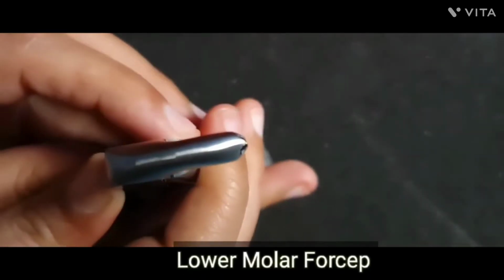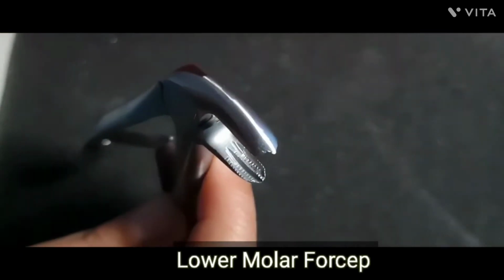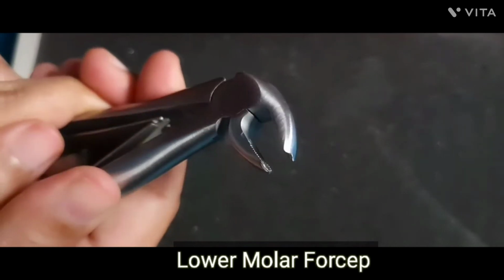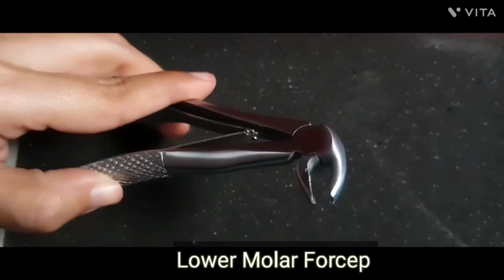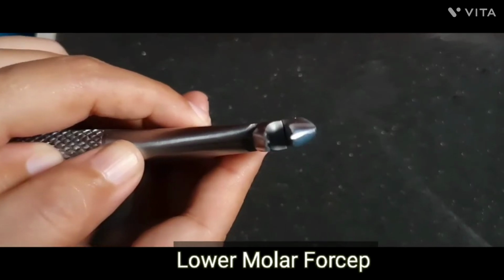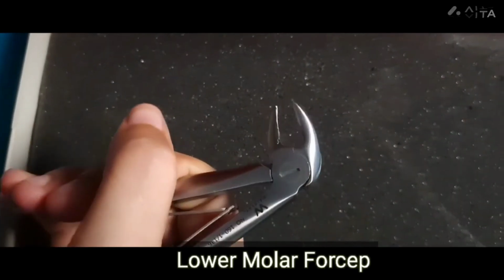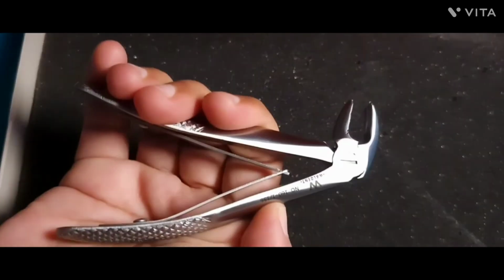The bend tells you this is a lower forceps, and from the beak you can see again we have a pointed beak which engages the furcation area, so it is a lower primary molar forceps. You can identify this forceps by the two pointed beaks that engage the buccal and lingual bifurcation. Apply the forceps and move the tooth in the buccal direction to expand the socket, to expand the buccal cortical plate. With the pointed or arrow beaks you can identify that this is a molar forceps.